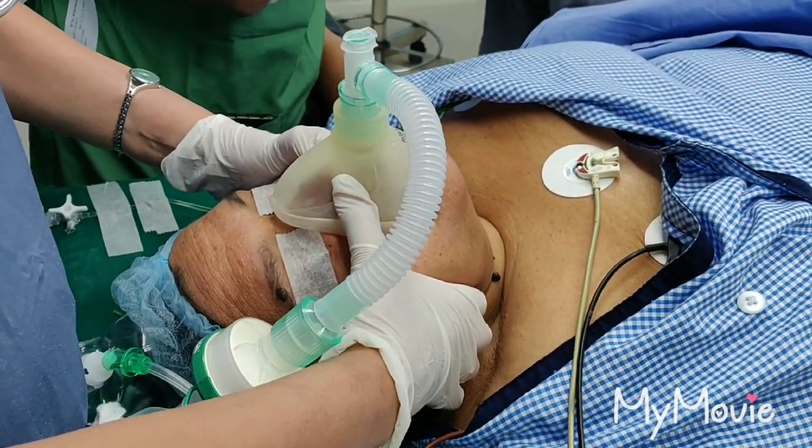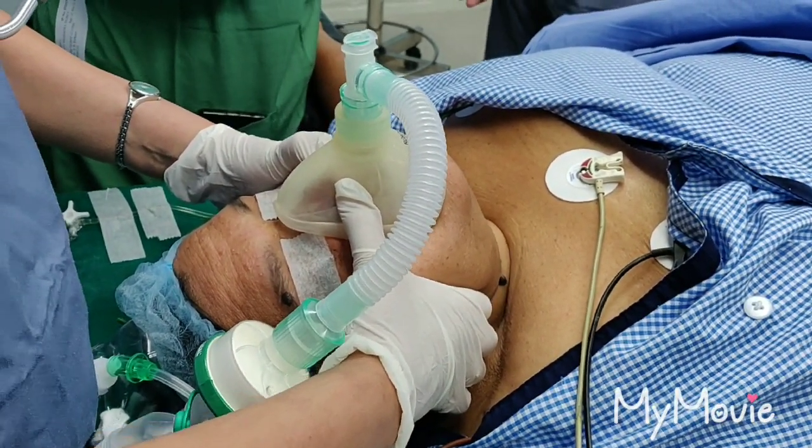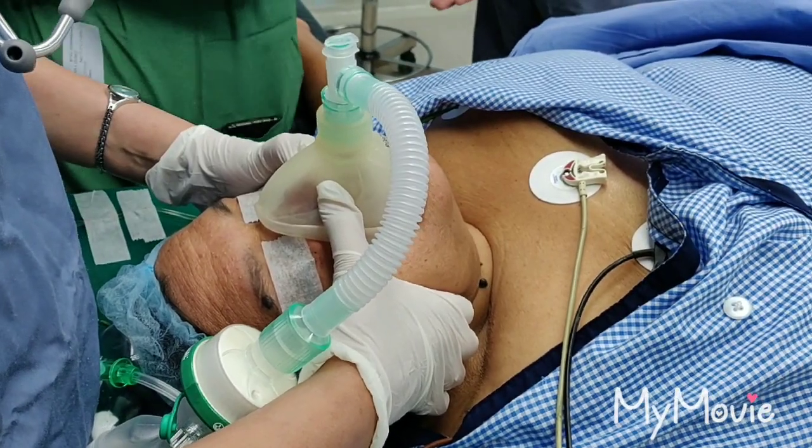Raja, can you give some more propofol, please? Twenty milligrams of propofol before we intubate, to blunt the pressure response of intubation.